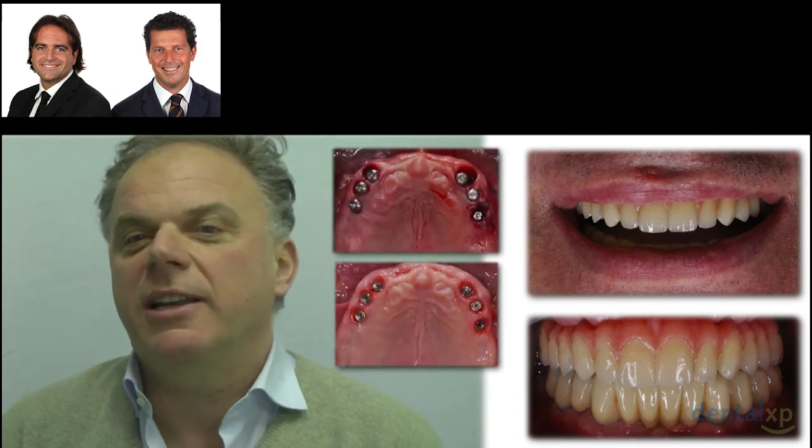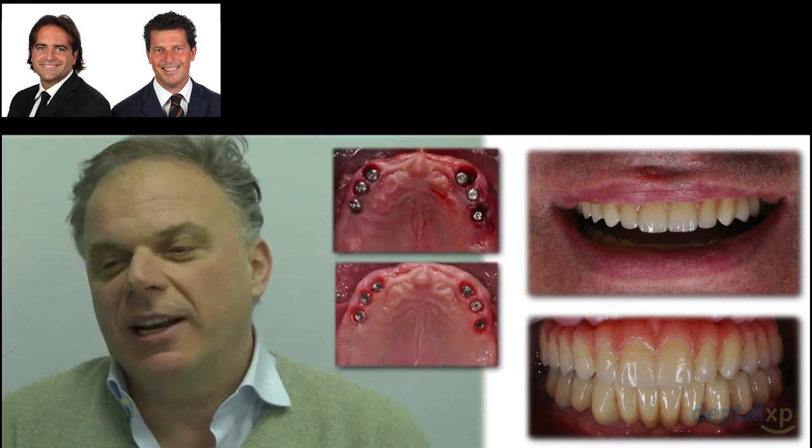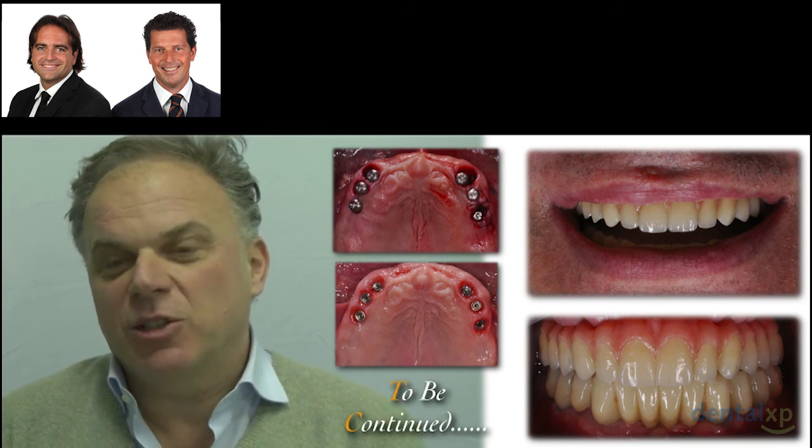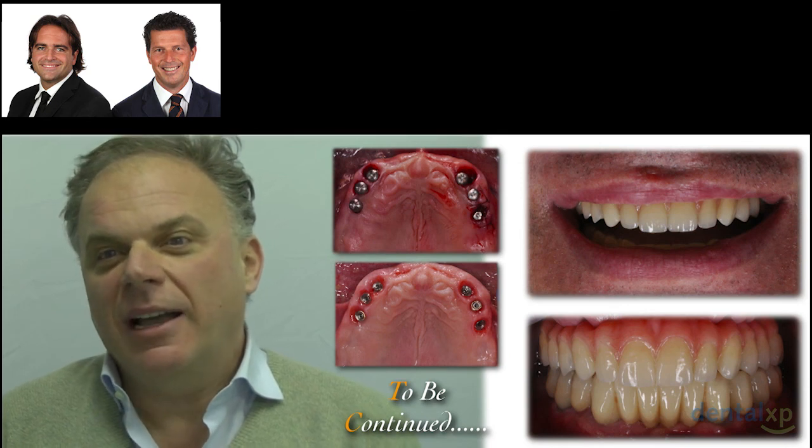And this is something that we did at the beginning of this year. We just unscrewed the provisional restoration, and this story needs to be continued.